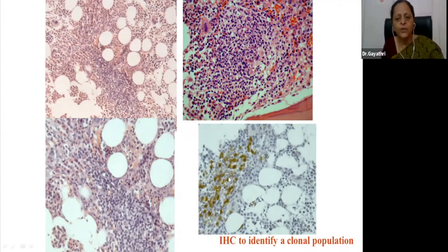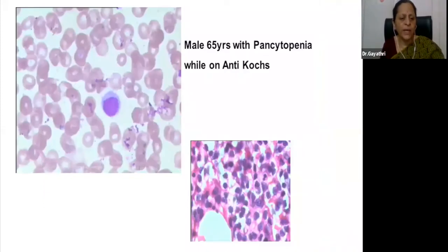But unless I do immunohistochemistry and prove whether these are monoclonal or polyclonal, I cannot interpret this marrow correctly. Here is a classical case.